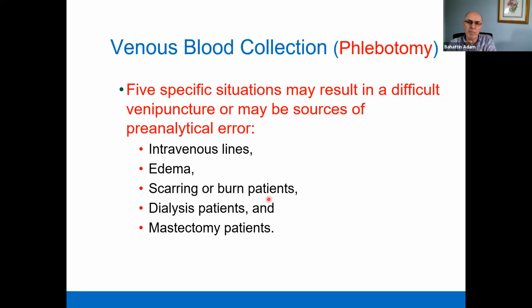Dialysis patients also may be difficult because usually they have an access site in one arm, and you have only one option without it, and the vessels of dialysis patients are usually hard to go through with the needles because of atherosclerosis.